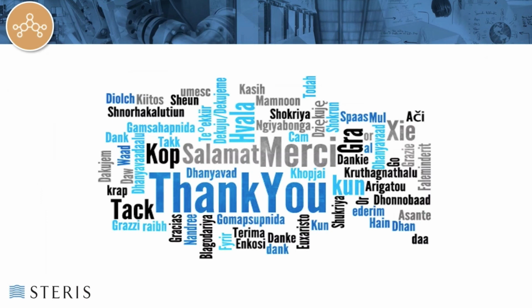Establishment of tolerable contact limits for ocular tissue, and also clarification that tolerable contact limits are based on acute exposure. Testing of a blank control sample could become optional and used more for investigational purposes than as a requirement. Clarifications regarding extraction temperature for exhaustive extraction, inclusion of minimum aeration time for product release, additional special category devices, and clarification regarding the length of patient exposure for these devices. And finally, more guidance on the factors influencing product residuals.